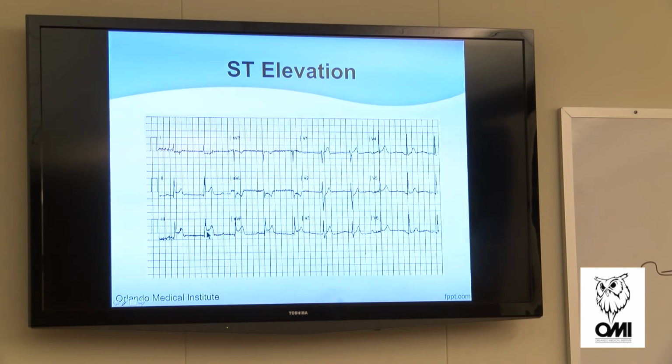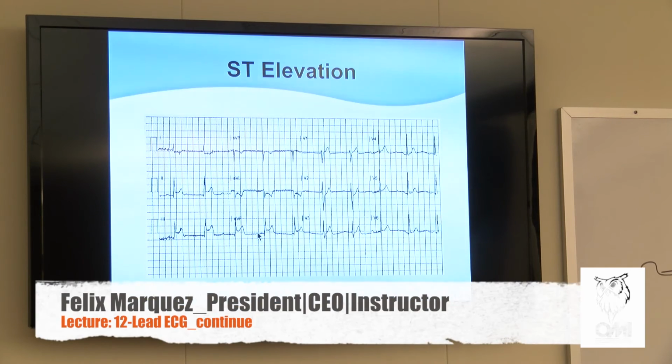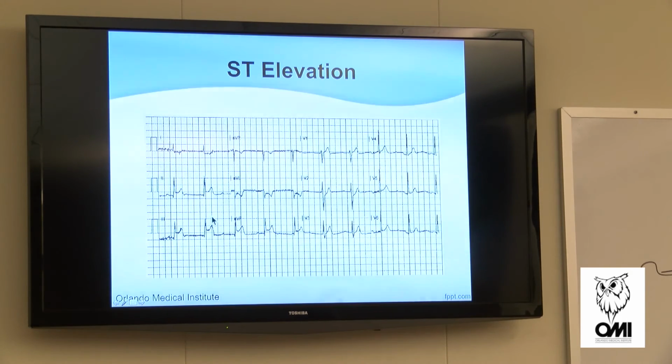Now let me go back one. Elevation. So if this is true ST elevation, what should I see on the opposite side? What's the opposite side? So I got depression here? Yeah. Do I got depression here? Yep. So is that true ST elevation? Yes, it is.